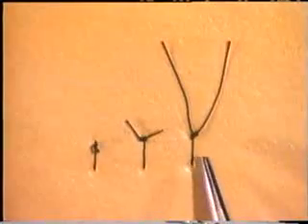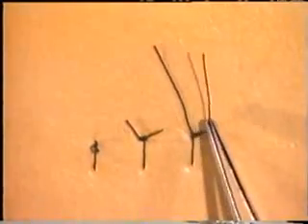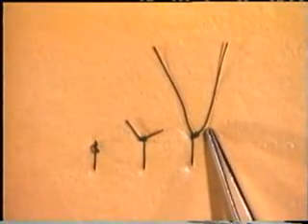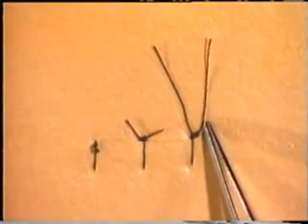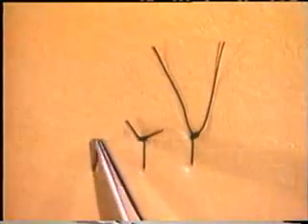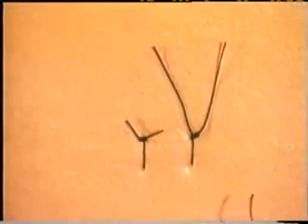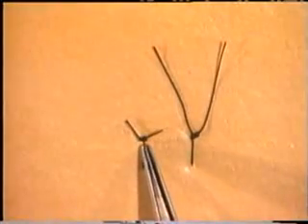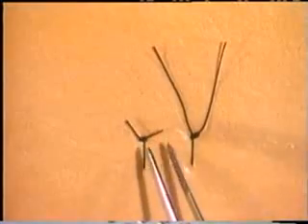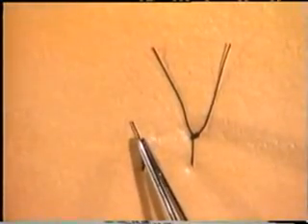When cutting sutures, do not cut them too long, as this long length of thread will be a needless waste of suture material and will get caught up in the wound or in the dressings. However, don't cut them too short, otherwise this will be insecure and might even lead to the unravelling of the knot. Cut the suture to such a length that it will be secure, and also allow the suture to be grasped during its subsequent removal.